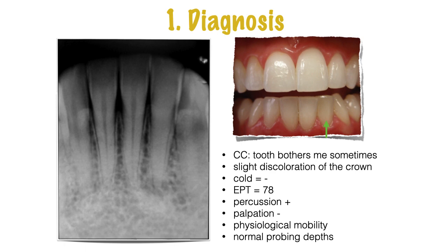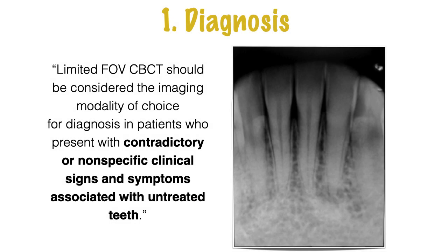Tooth responded within normal limits to palpation. You had physiological mobility, and the probing depths were below 3 millimeters. In diagnosis, limited field of view CBCT should be considered the imaging modality of choice for diagnosis in patients who present with contradictory or non-specific clinical signs and symptoms associated with untreated teeth.